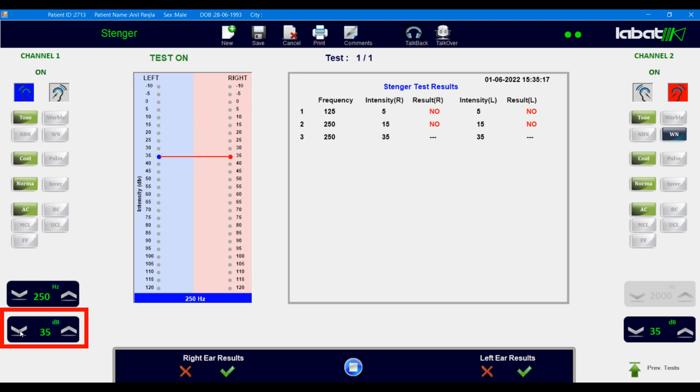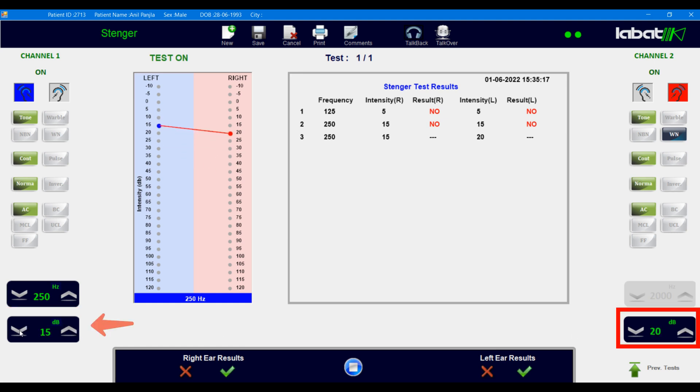It is used to change left ear dB. It is used to change right ear dB.